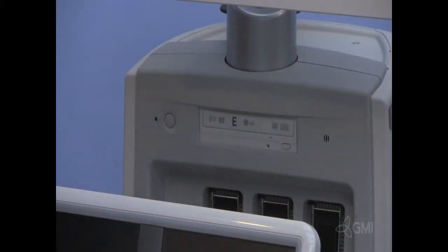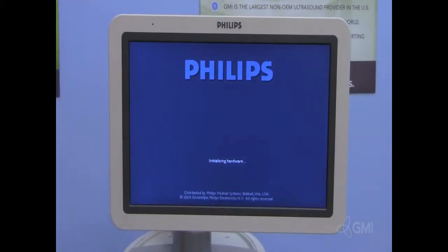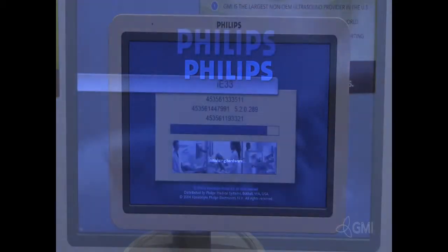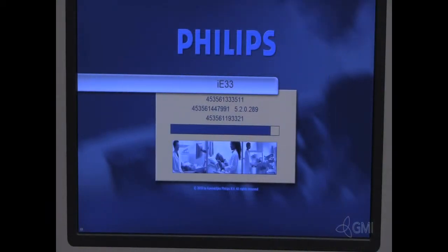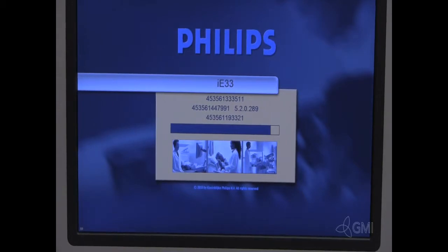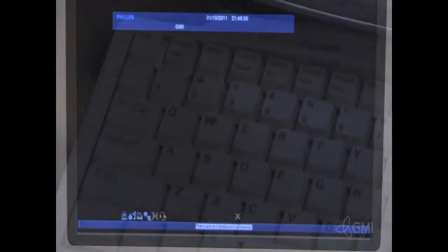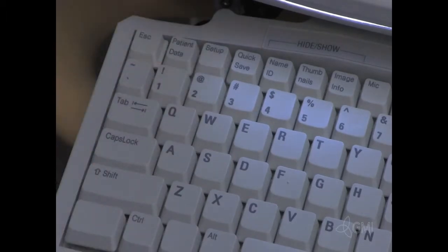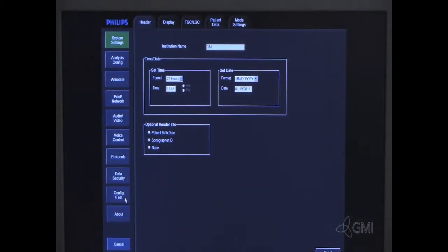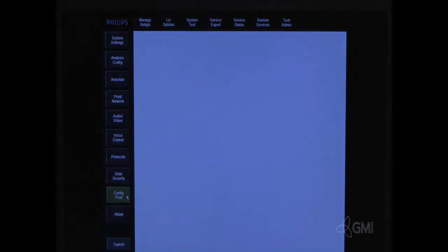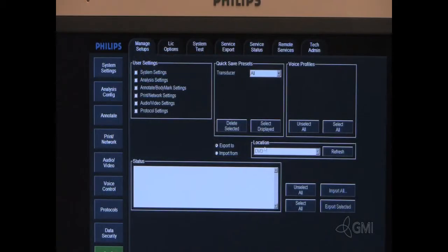Power the system on. Press the setup key. Enter config test and tech admin.